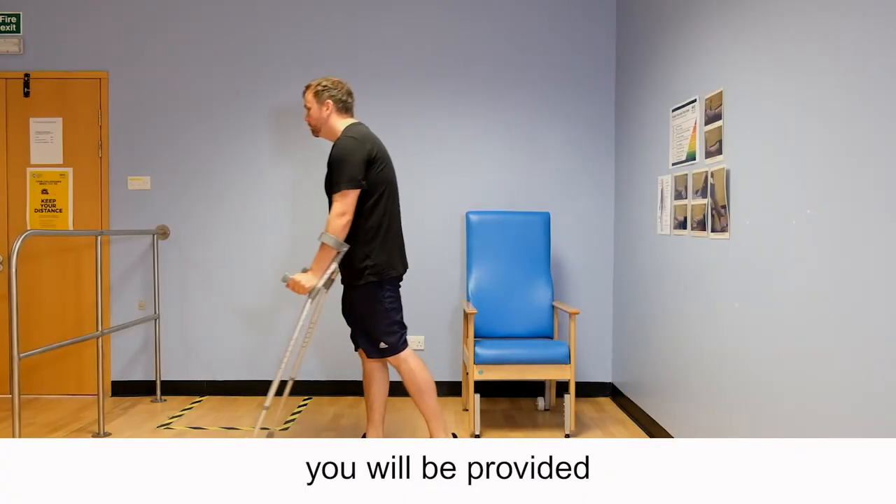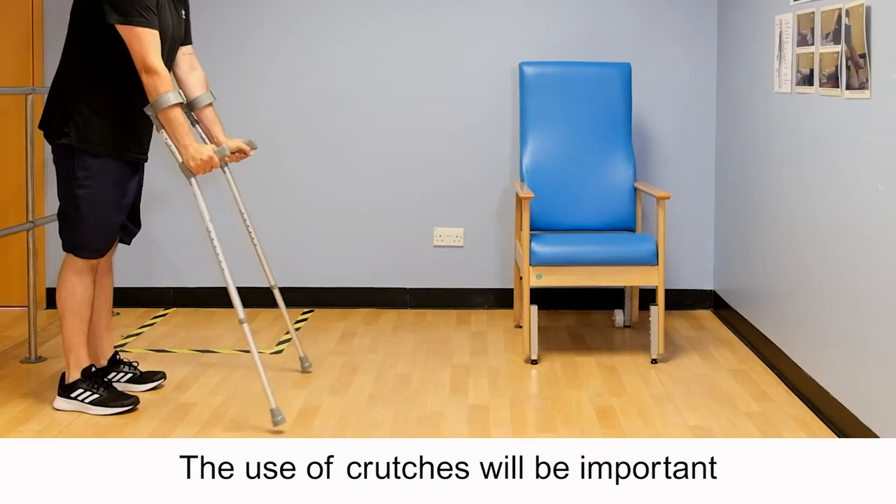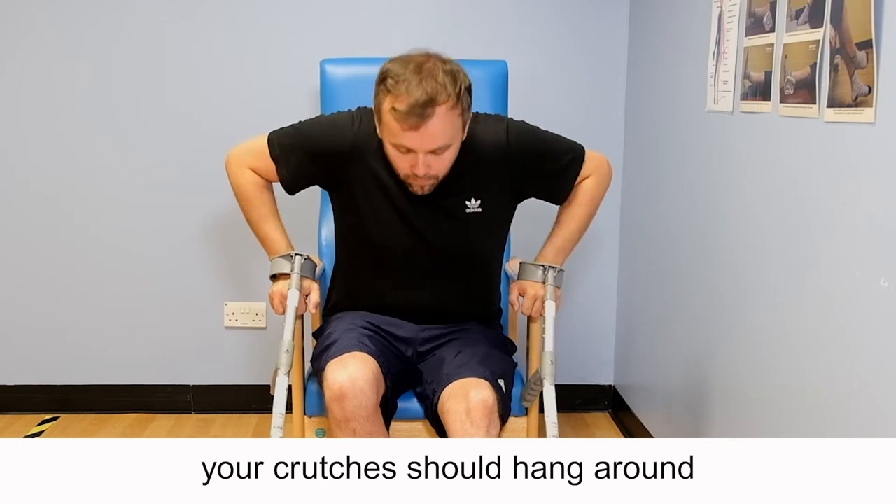After your operation you will be provided with a set of crutches. The use of crutches will be important when you require to get up and move around. When standing up, your crutches should hang around your wrists like bangles.